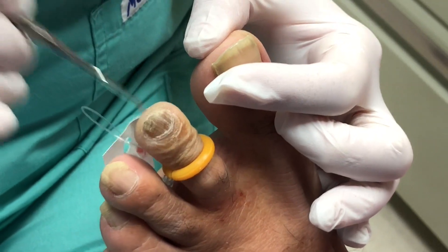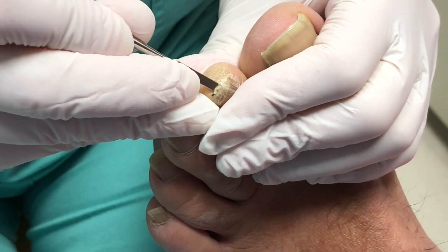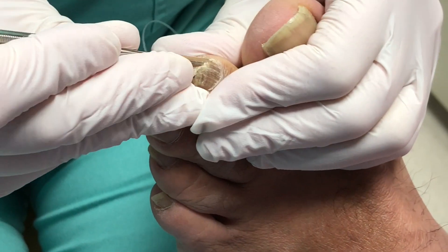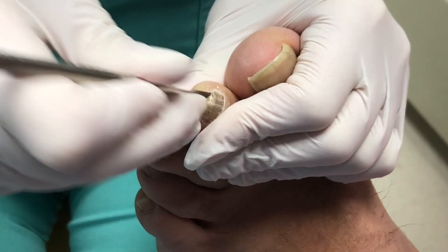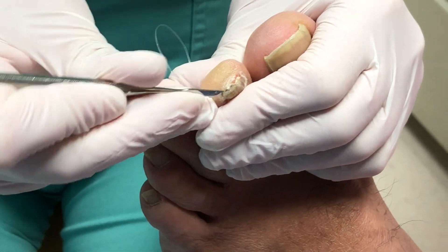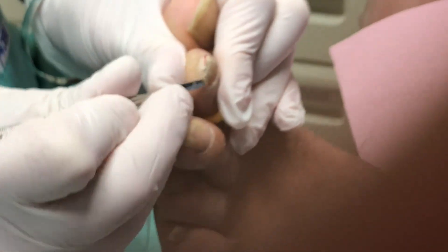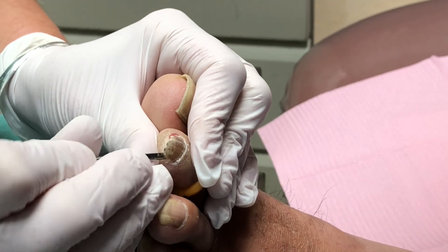I've got a tourniquet on, he's frozen, he cannot feel a thing. So the first thing we do is we have to separate the nail from the nail bed. When the nails are a little thicker like this, sometimes it's a little harder to break the seal. The nail is on the nail bed like a suction cup, so it's just breaking the suction. But because of the trauma to this nail, the skin underneath is atrophied, it's calloused underneath, so it's hard to kind of pry the nail off to get that suction going.